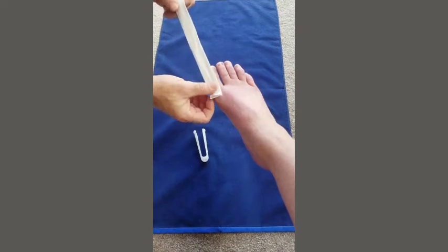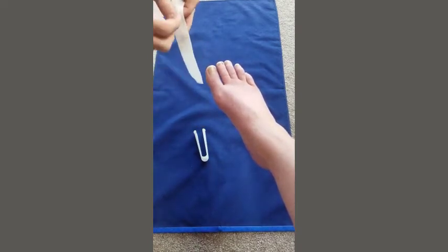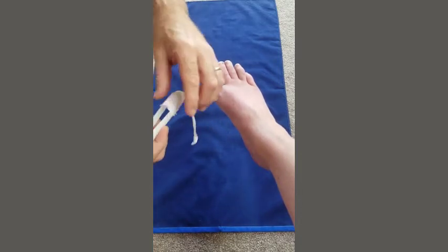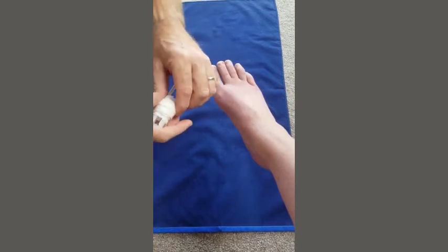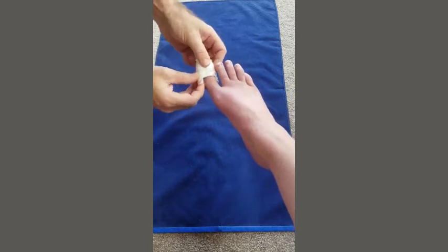Take about three times the length of the toe you're trying to dress. This is for the big toe, so we've got one, two, three times the length, and apply that to the rounded end of the tube applicator, loading it all the way on. You then open up the other end to put it over the toe.